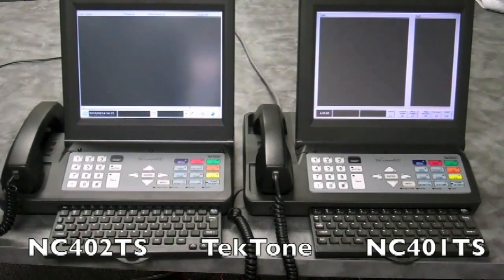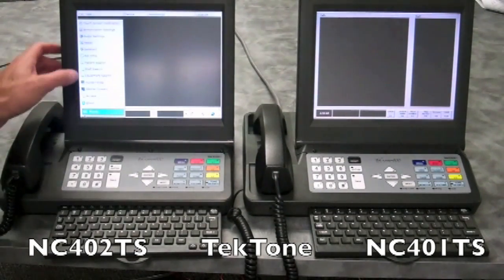The NC402TS shares its list view, as seen here, with remote monitors that can be used on other facility computers. This provides consistency throughout the facility and also provides the ability to use this in black, or you can change the screen to white.